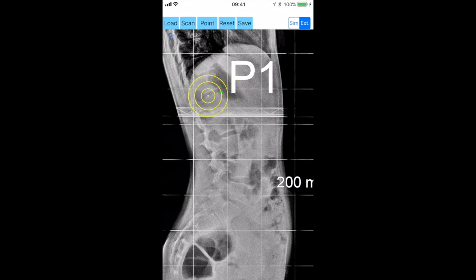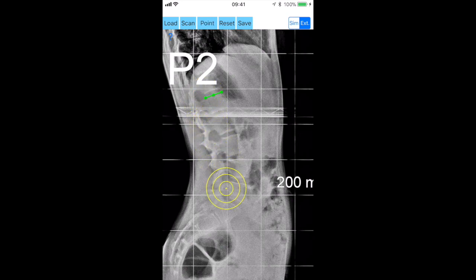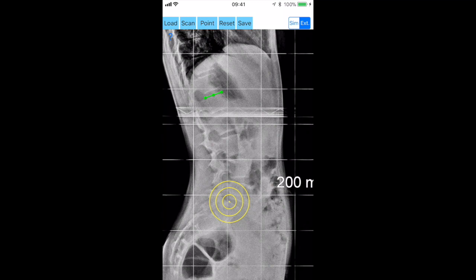The order of marking does not affect the measurement. A green line P1-P2 over the anterior and posterior superior end plate of the vertebra body of L1 appears.